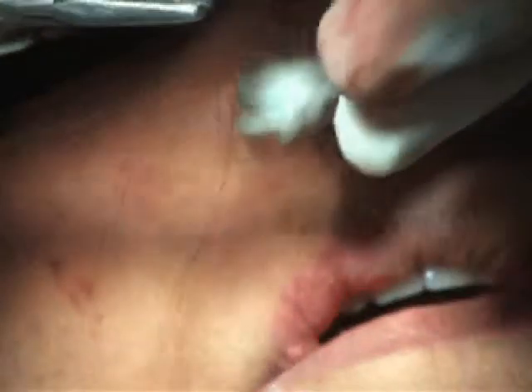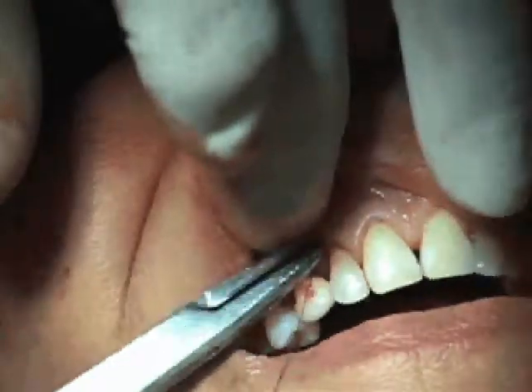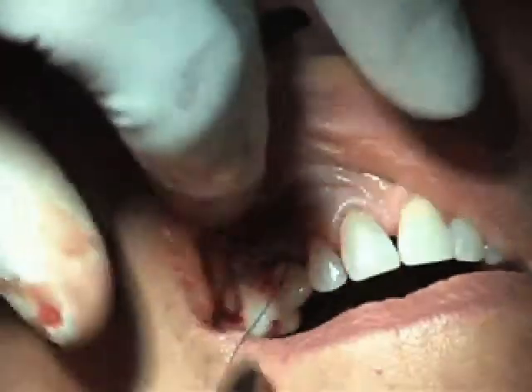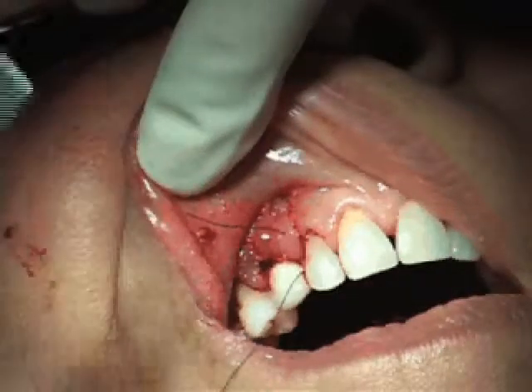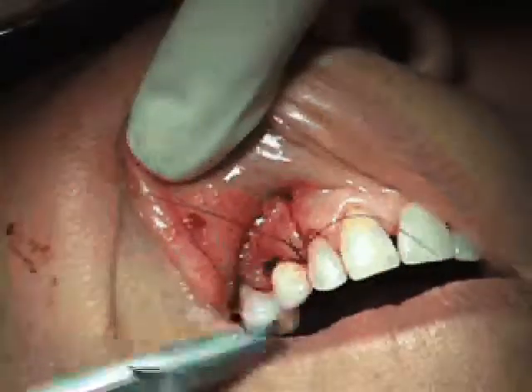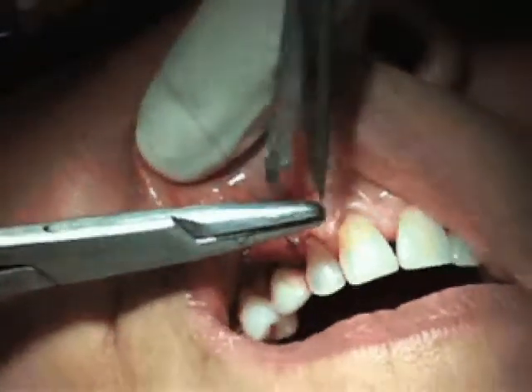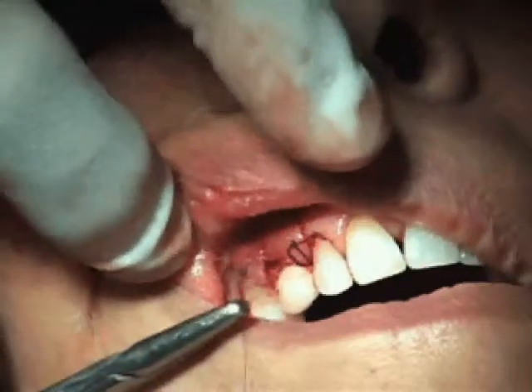I'm going to take silk to suture this together. It's very delicate suturing. I'm going to put the lip up. There are a couple sutures proximally to tie down the flap; I'm going to put it in the inner proximal.